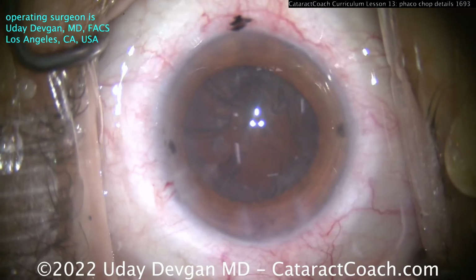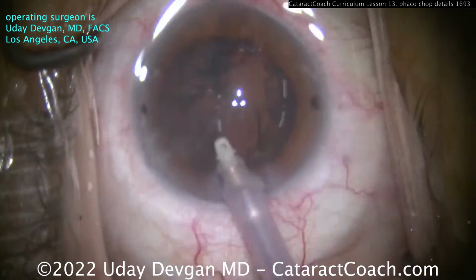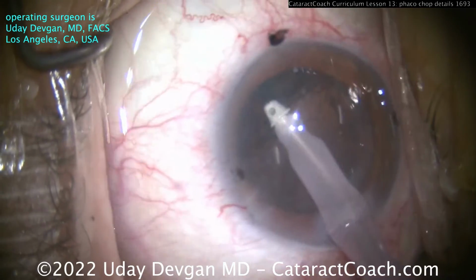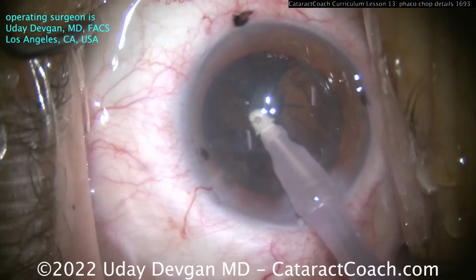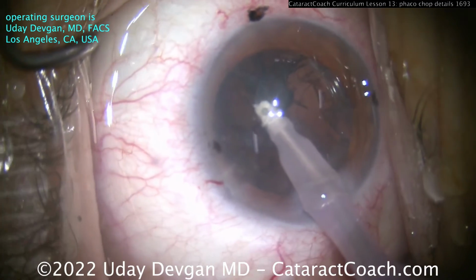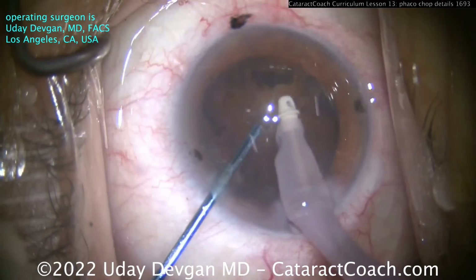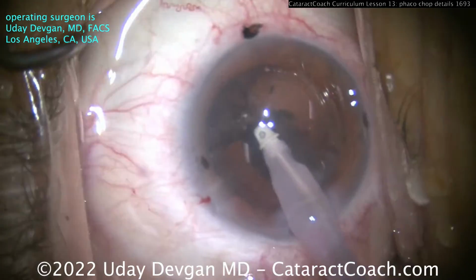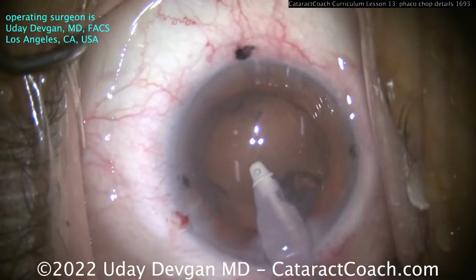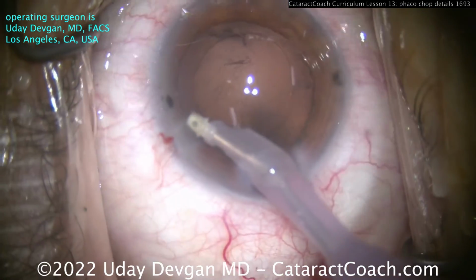So good. 2 to 3+ NS, check. Second thing, it's going to be the rhexis, it's got to be 5 millimeters. And third thing is, after I do that one chop and separate the two halves, the chopper pulls the one heminuclear piece out of the way to create more of a gap that allows me to bring up the other heminuclear half using the vacuum of the phaco probe. And once that's gone, then it's very easy to remove the other piece and proceed from there.